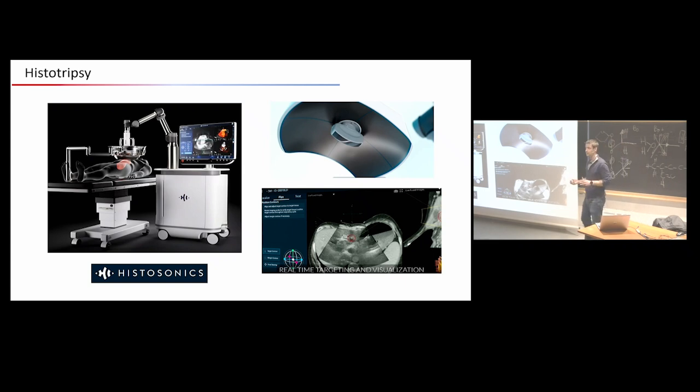So they are trying now to apply that for clinics and for tumor destruction by using histotripsy. So I told you at the beginning we can use that to destroy kidney stone, to destroy things into the body. Here, this is an application for tumors specifically, and you see they have a therapeutic transducer like that, in which an imaging probe, a basic ultrasound imaging probe is inserted, and so they are able to guide their therapy and to have a therapeutic effect in real time.